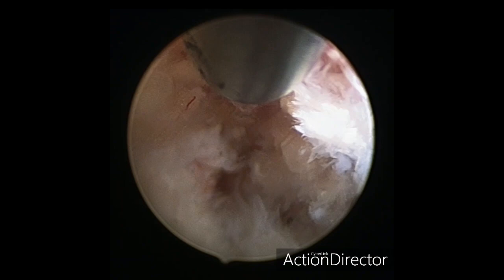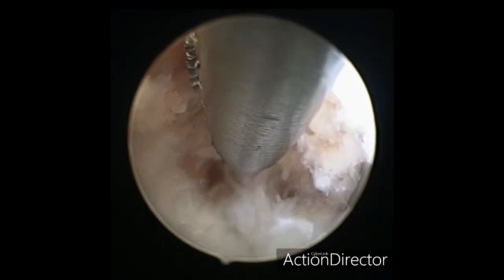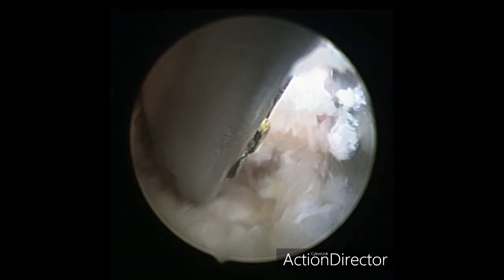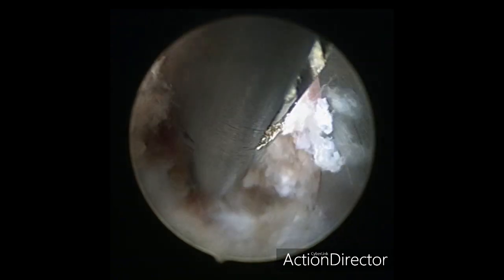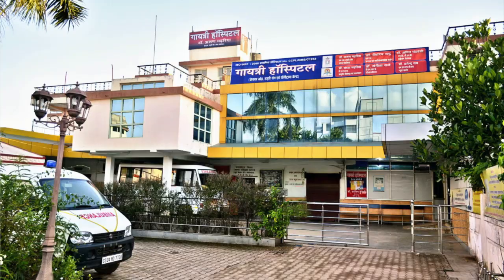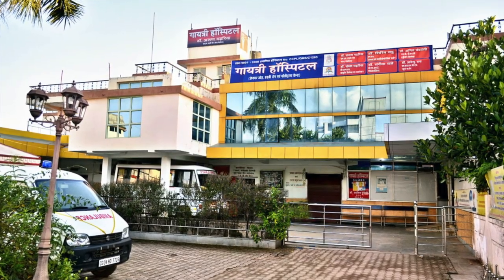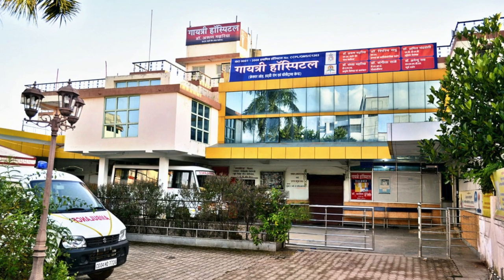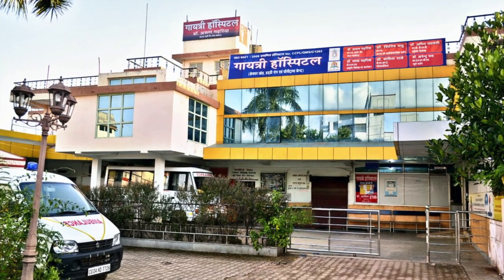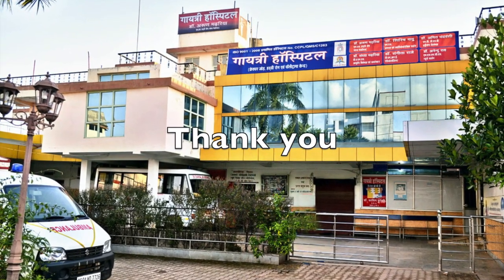This procedure is thus completed. It was done completely under local anesthesia in an alert and conscious patient. The patient was allowed to walk after three hours of the procedure and has got complete relief from her leg pain.